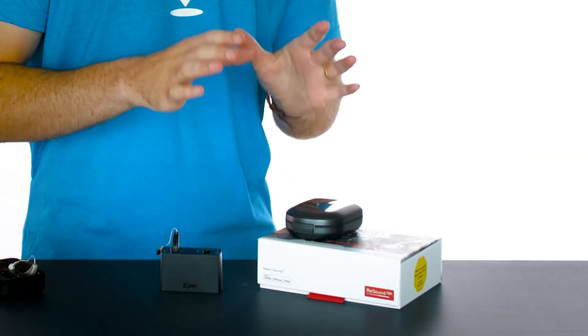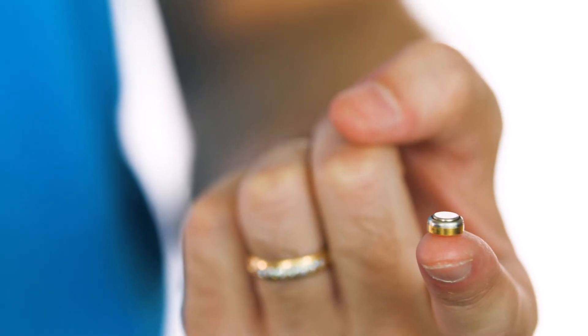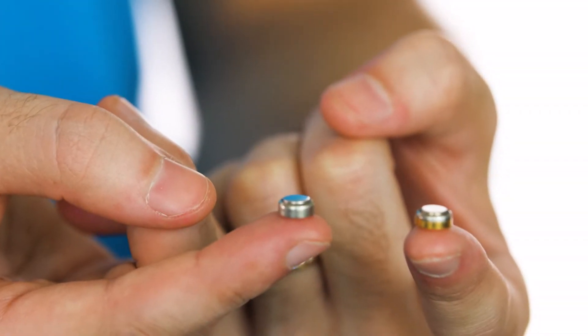Here we have a hearing aid powered by a silver zinc rechargeable battery. This is a silver zinc rechargeable battery, and this is a regular disposable hearing aid battery. You can see they look almost identical.